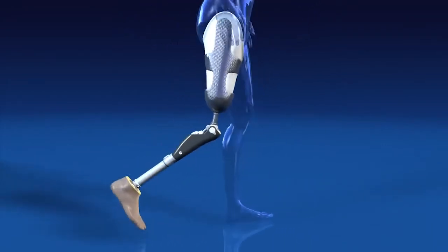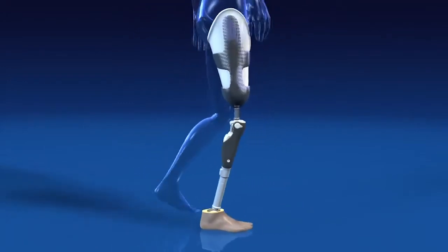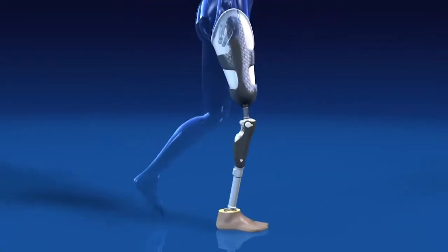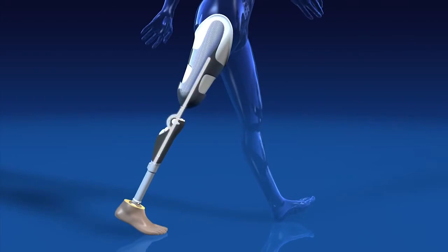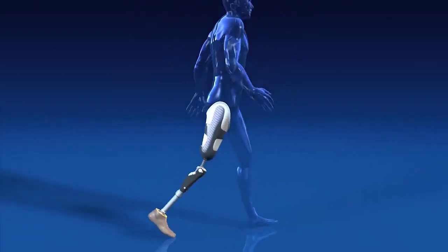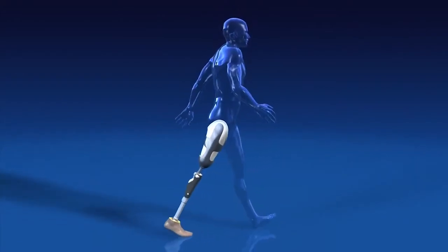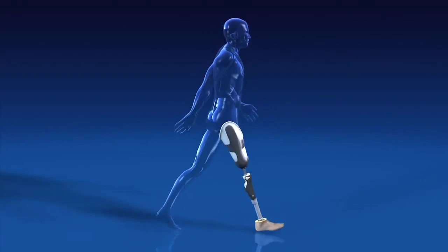The Sea Leg has a high level of hydraulic damping in the stance phase, offering security right where it is needed. It only leaves this secure state when two criteria are met simultaneously: the knee must be fully extended and approximately 70% of the body weight of the prosthesis wearer must be supported by the forefoot. Only then does the prosthesis switch to the swing phase. This is how the intelligent, state-of-the-art control unit of the Sea Leg assures high safety for the prosthesis wearer.